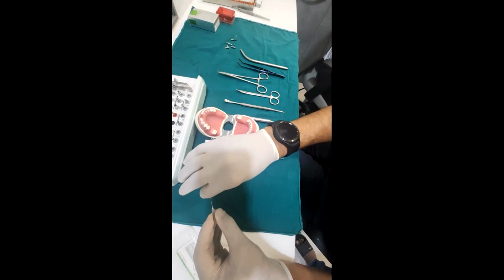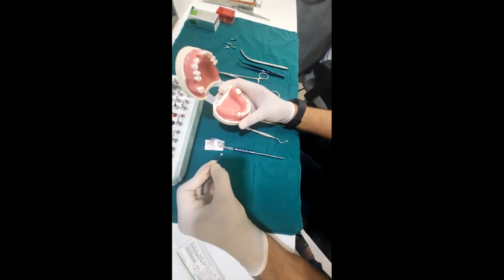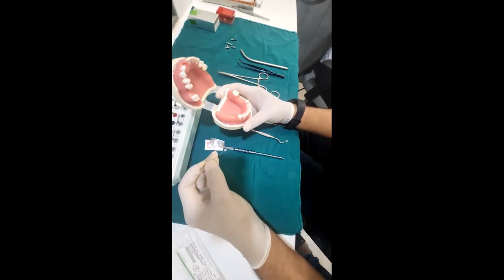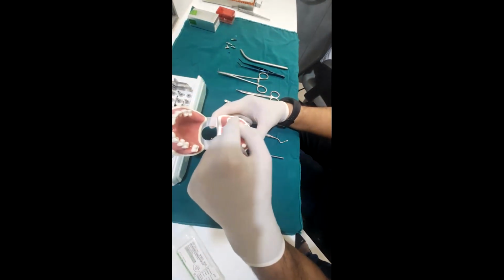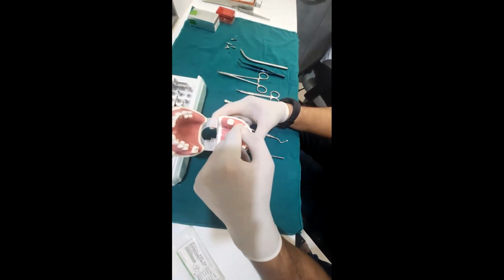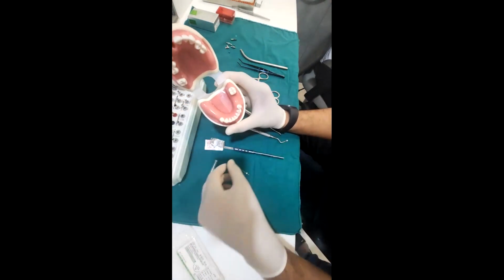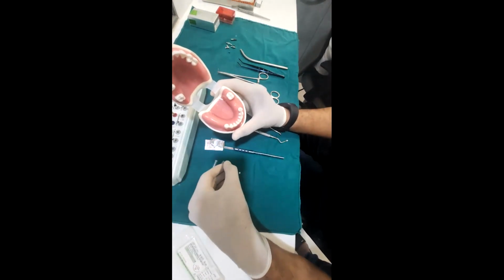Basically, when I had mentioned how you evaluate a case and you might not have the opportunity of having a CBCT, then after having a master cast like this, you make the surgical guide by putting two denture teeth over here and trying to make a denture so that it acts like a surgical stent through which you have your center holes to ensure the placement.